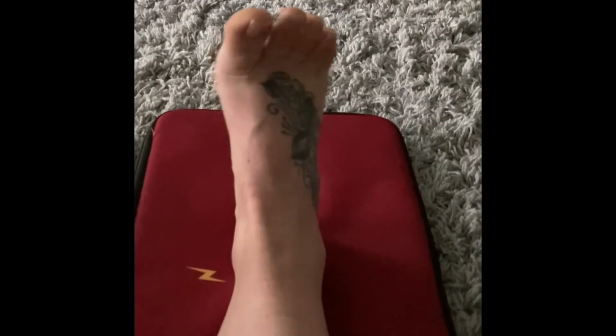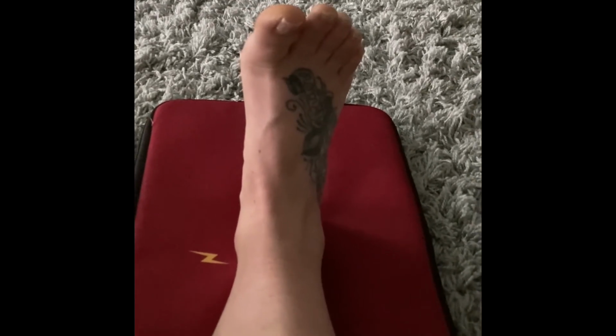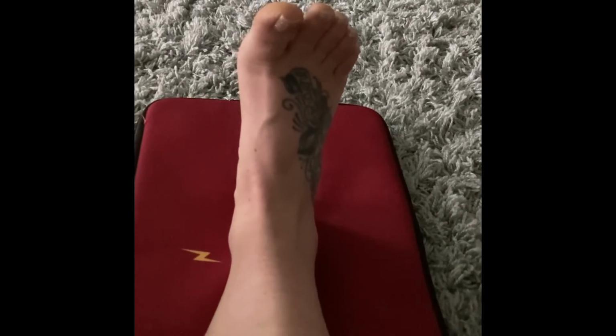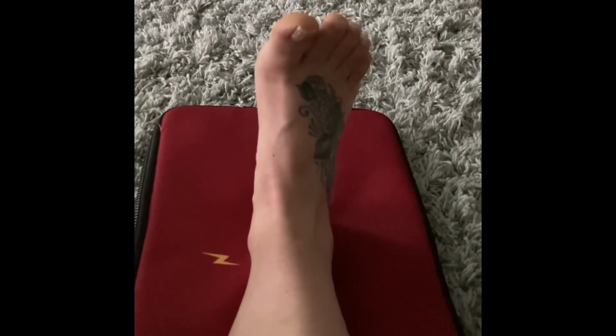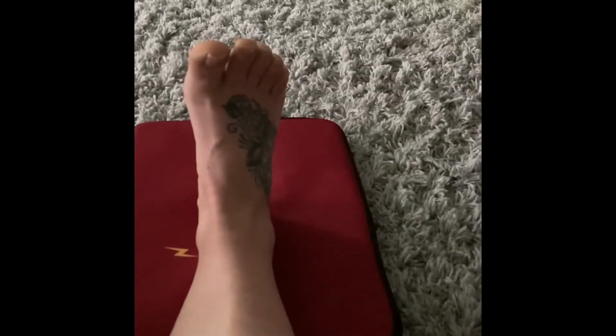And you should be able to see the plantodorsal projection of the calcaneus from the tuberosity to the sustentaculum and trochlear process for that. And that is all for those views.